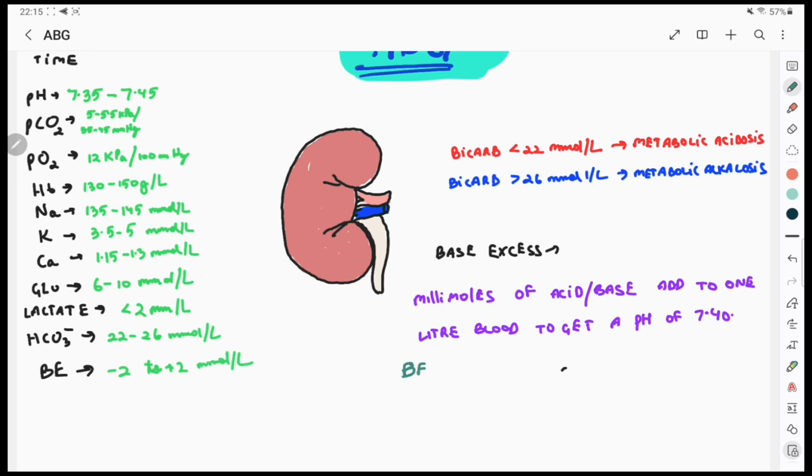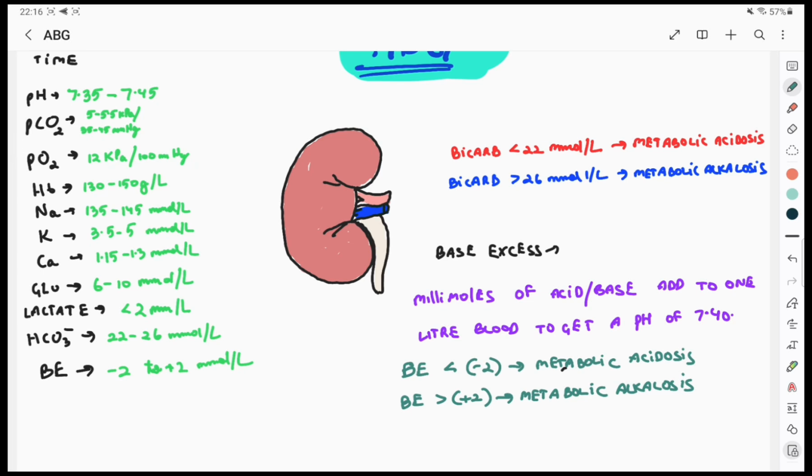If the base excess is highly negative, this is often called a base deficit. It means that there is a shortage of base in the blood because it's been used up fighting off excess acid. This confirms a metabolic acidosis. If the base excess is highly positive, it means that there is an absolute surplus of base floating around in the blood, confirming a metabolic alkalosis. If you ever find yourself looking at a borderline bicarbonate number and you're just not quite sure if this is a true metabolic issue happening, glance down at the base excess. If it's worse than -2 or higher than +2, it confirms that a true metabolic derangement is underway.